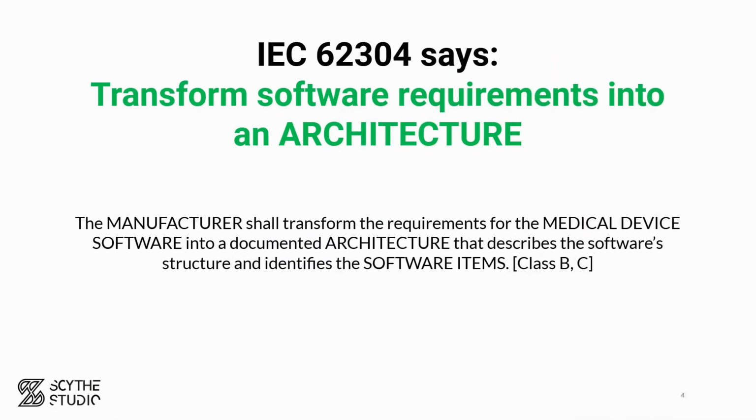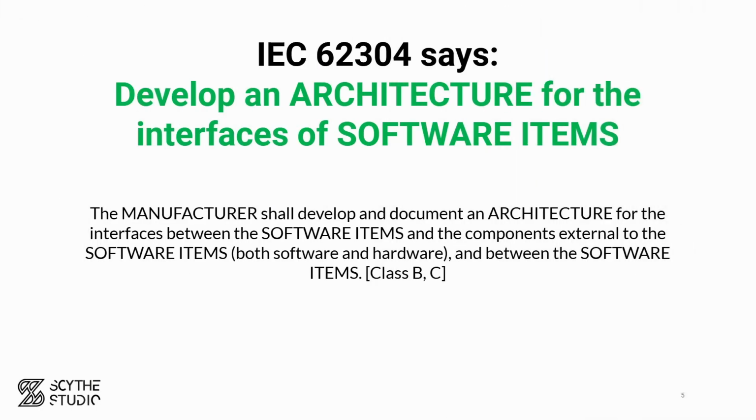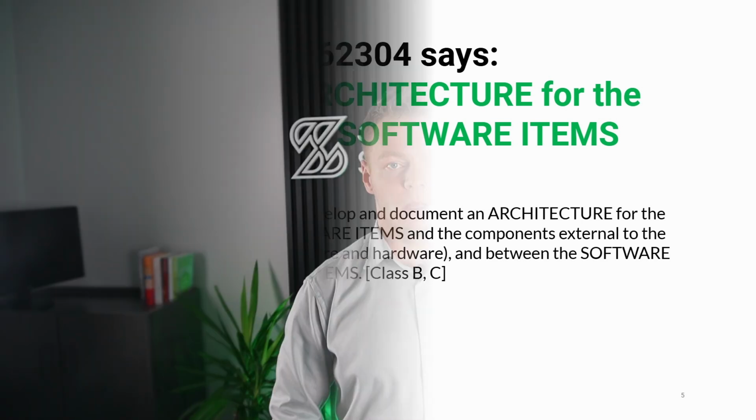It does tell you two things. First, you have to document architecture describing software's structure and identifying software items. Let's call it a high-level documentation. And you have to prepare interfaces documentation, so the actual communication between system components.